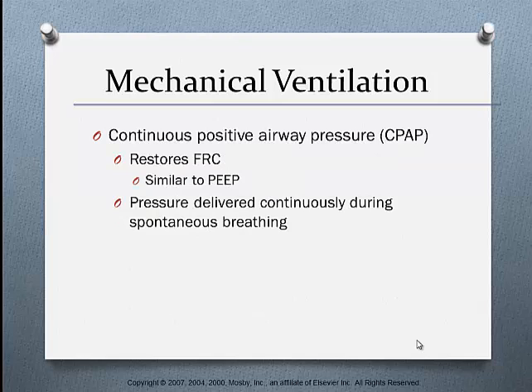CPAP, our continuous positive airway pressure: the pressure is delivered continuously during spontaneous breathing. It prevents the airway pressure from falling to zero. It's often used for sleep apnea. It does increase our work of breathing because the patient must forcefully exhale against the constant pressure.